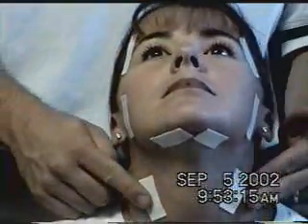For the SCM here and here, we have the patient turn their head all the way to one side and then look down. You can see how that pulls the rope-like muscle and makes it much easier to see. Then we just take the electrode and run it right along that muscle, in line with the muscle fibers, and have it attached there.